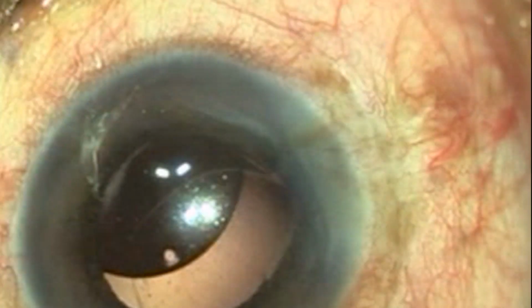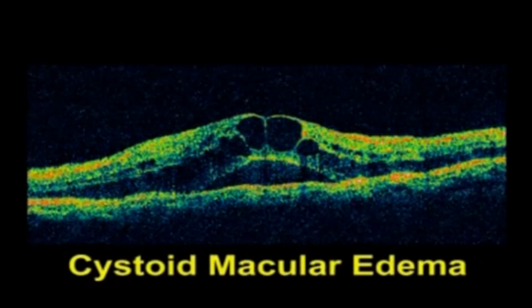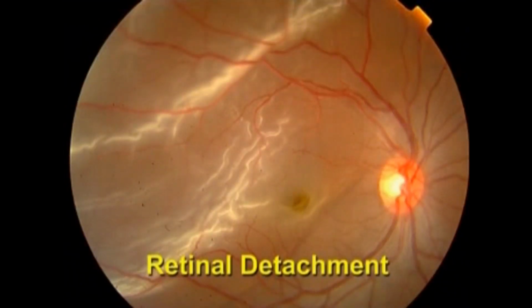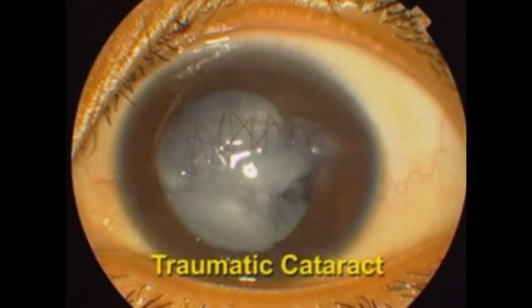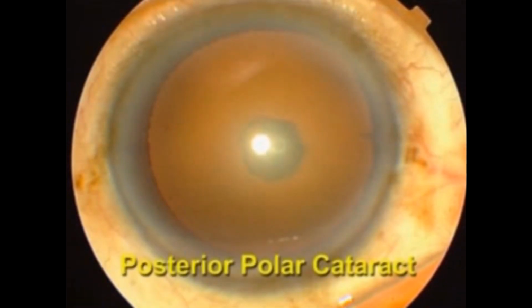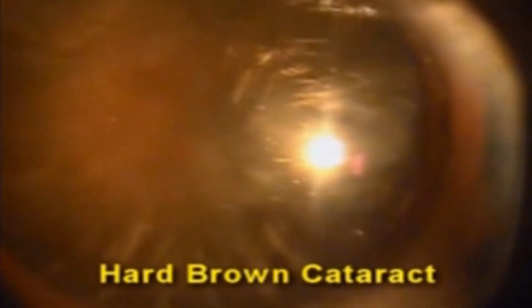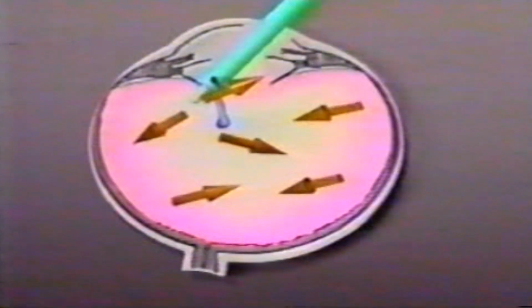Failure to manage the PC rupture and the vitreous loss correctly can lead to cystoid macular edema, retinal detachment, secondary glaucoma, and even postoperative endophthalmitis. Surgeons should anticipate PCR in traumatic cataracts, cataracts in post-vitrectomized eyes, posterior polar cataracts, hard brown cataracts, and cataracts with pseudoexfoliation. This animation shows how the vitreous acts like a slinky.